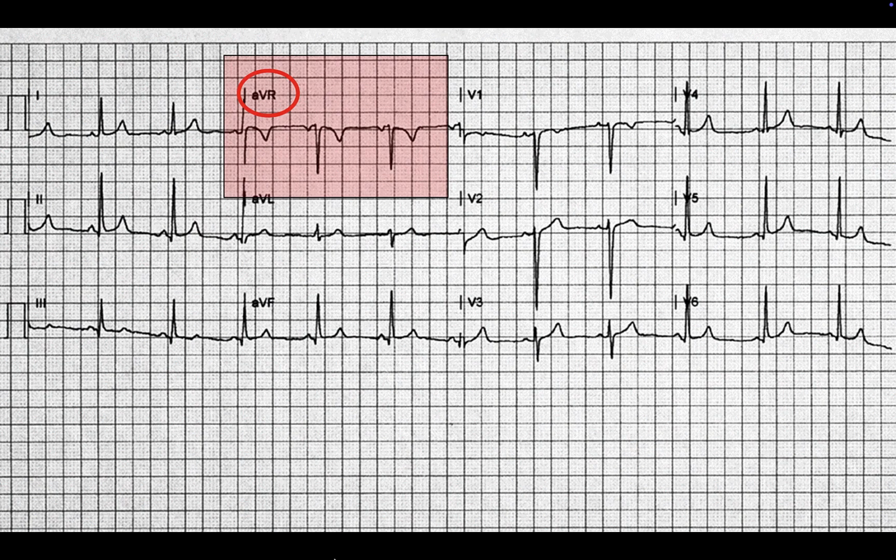So in this example, you look at AVR, that view from the right, as if you had your camera positioned at the right shoulder, and all the electrical activity should be moving away from the camera, meaning that the majority of your QRS should be below the baseline, like you see here. That means your leads are likely hooked up properly.